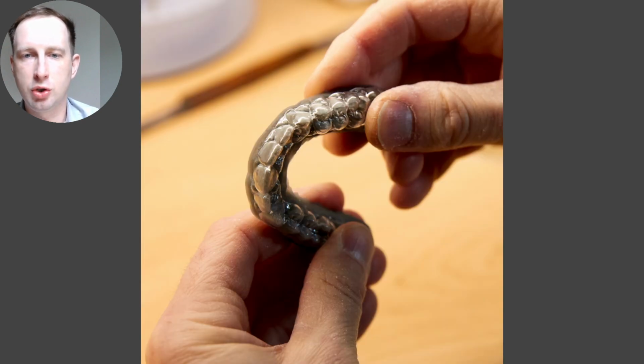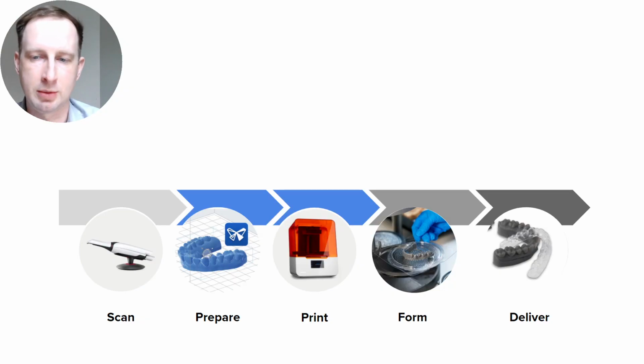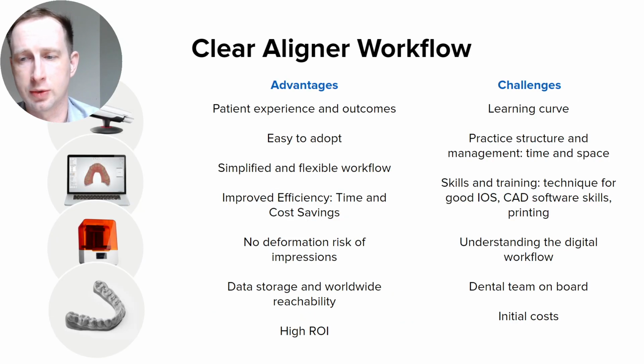But this is the huge benefit to doing it like this, as opposed to trimming with a cutting disc directly, is the edges, if done right, can be very clean and really need no processing afterwards. Some use cutting discs and trim to the edges, and then use a Scotch-Brite or a buffing wheel to trim off that flashing. I don't really love that process. It's also kind of messy. So if you do it once correct with a sharp pair of scissors, it really saves time, in my opinion. But again, whatever works for you.